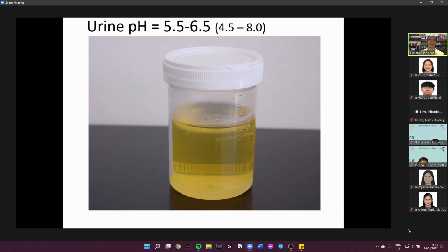to investigate further because certain foods can impart an alkaline urine. I'm not sure what these foods are, but what I've heard, like cranberry juice, your grapefruit. I don't know about buko juice, yung coconut milk, if it imparts an alkaline urine.